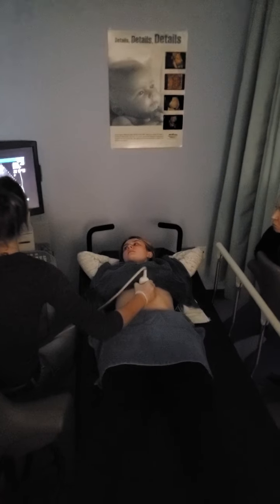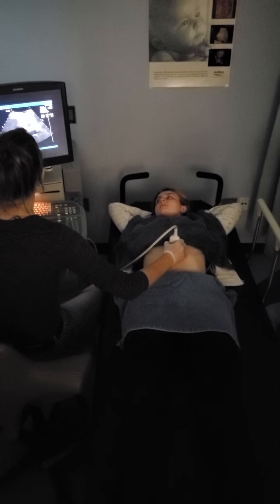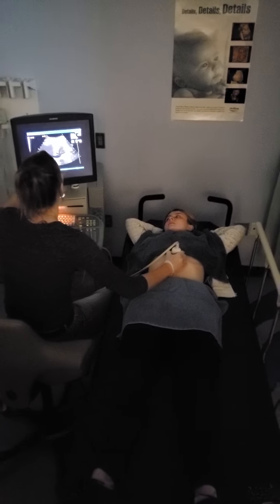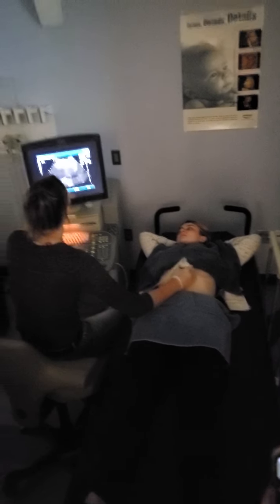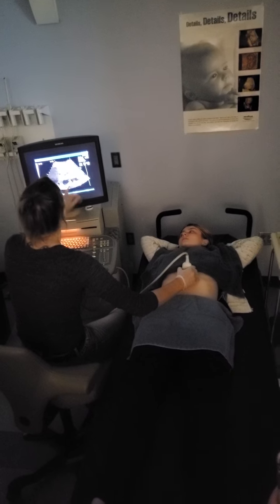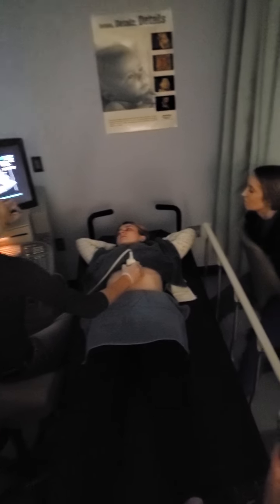So I'm going to come up into this transverse plane. I know I need to get rid of my depth. IVC is right in here. Go ahead and big breath in and hold it. So I'm going to wait for this kind of portal vein to cross the IVC. So I'm all the way up in the dome. I'm angling slightly inferiorly. Well, there's a portal vein, but look how much room is between this and it wants to go into the liver. So that's my left portal.